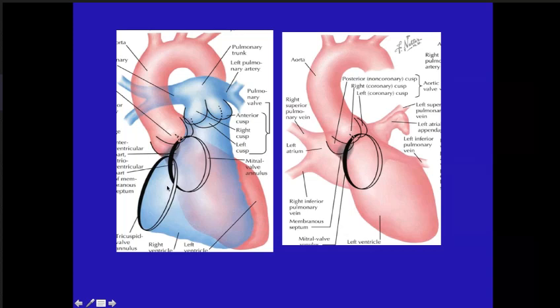When the dye goes into recirculation, all the way from the pulmonary artery to the pulmonary vein and back to the LV, you will see the left ventricle filling, and at that time you will see this. Now, you don't see the LV here because the LV is hidden behind the RV, and the contrast has to reach the LV through the pulmonary vein to be visible. So, in a frontal X-ray, you see this view. If you take away the RV, or if you do an RV angio and follow it through the levo phase, you'll see the LV.